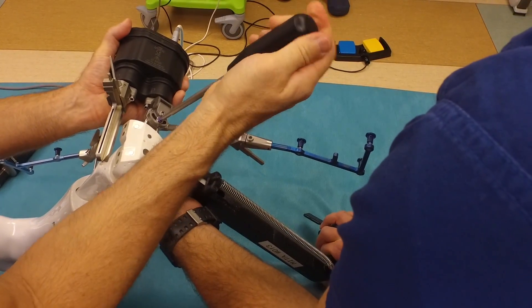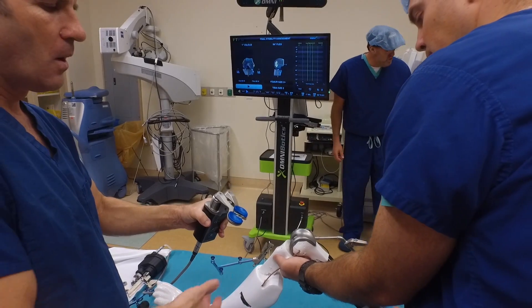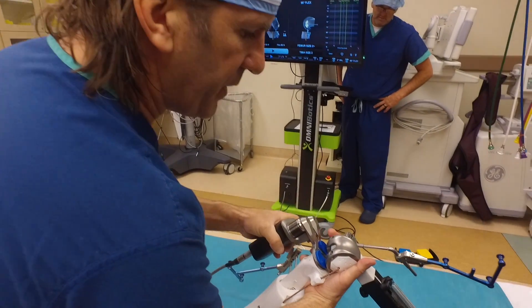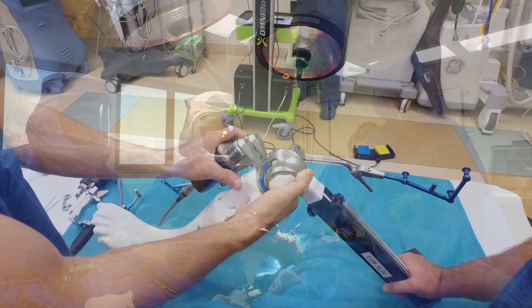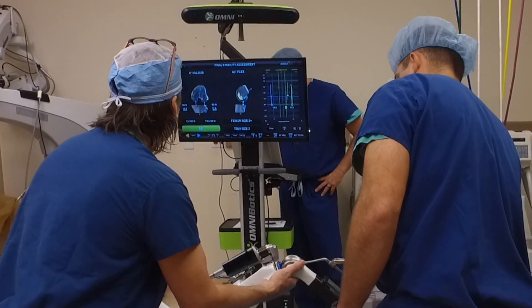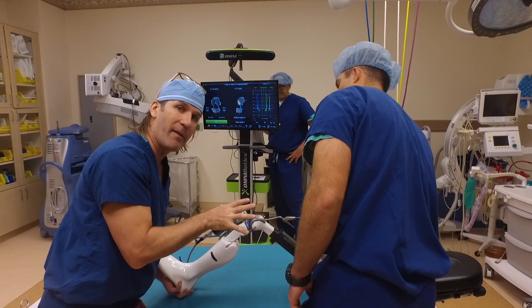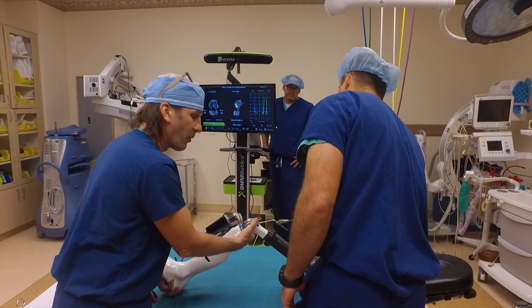We go ahead and remove the robot, then put on our trial femoral component. We put the tension measuring device back in there with little paddles to imitate the actual tibial component. With our femoral trial in, we re-trial and ask: did we recreate what we thought we were going to create? We tension those and read it on the computer screen, taking it through motion to see where we're sitting. From that we can make adjustments if we feel we need to release any ligament to balance it. We've got to make sure all our cuts are okay, as this is how it's going to sit in our final view — so it lets us see all that before we put in our final components.